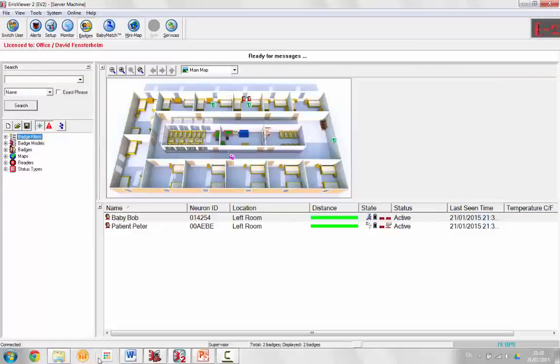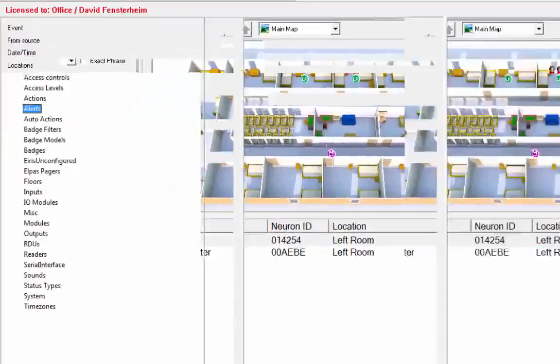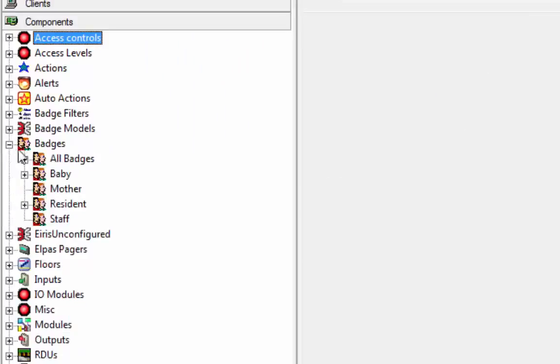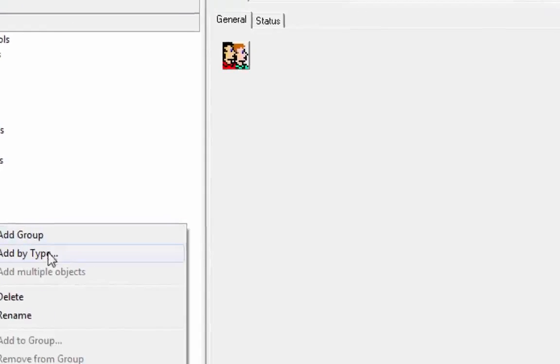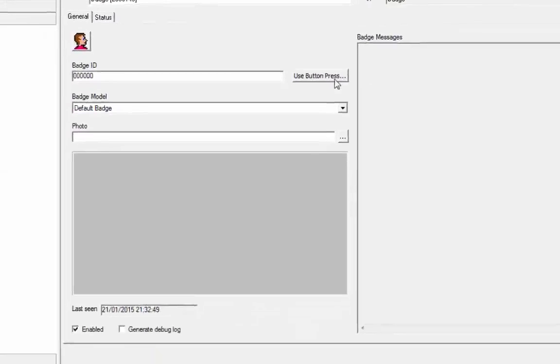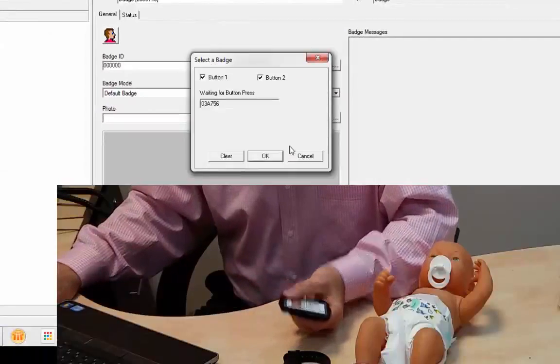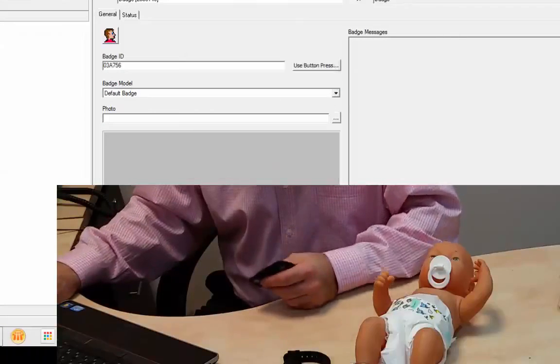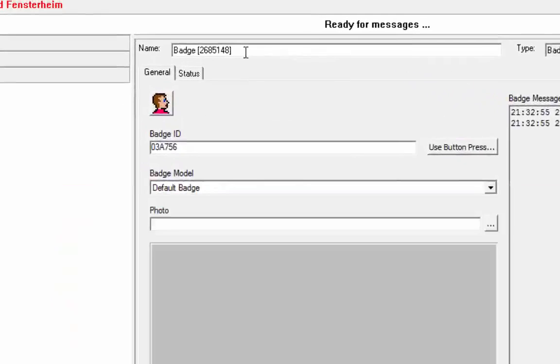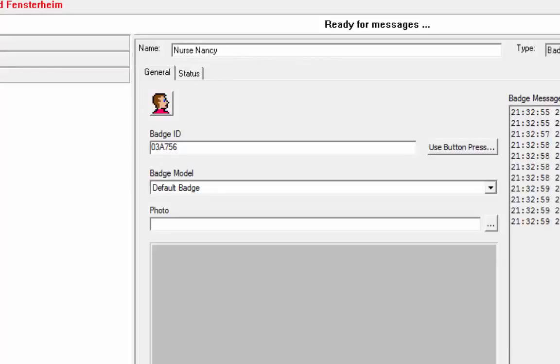The next thing we're going to do is define an escort tag, so a staff tag. So, let's do badges, staff, add by type, and we're going to use button press. Press the staff button to get the ID. Call it nurse Nancy.